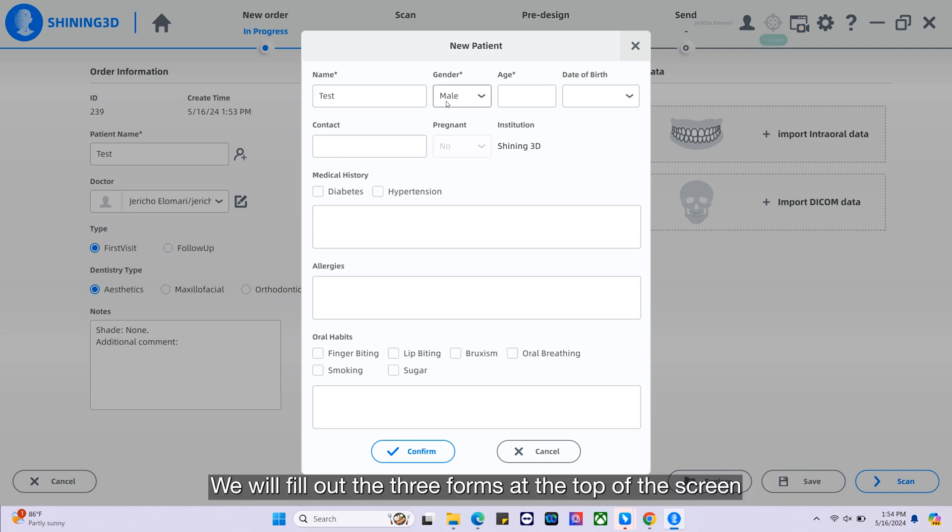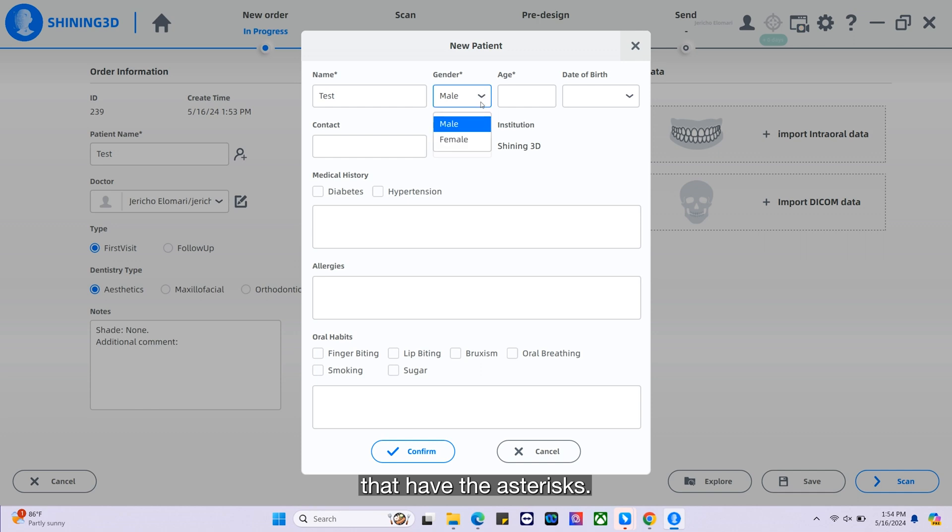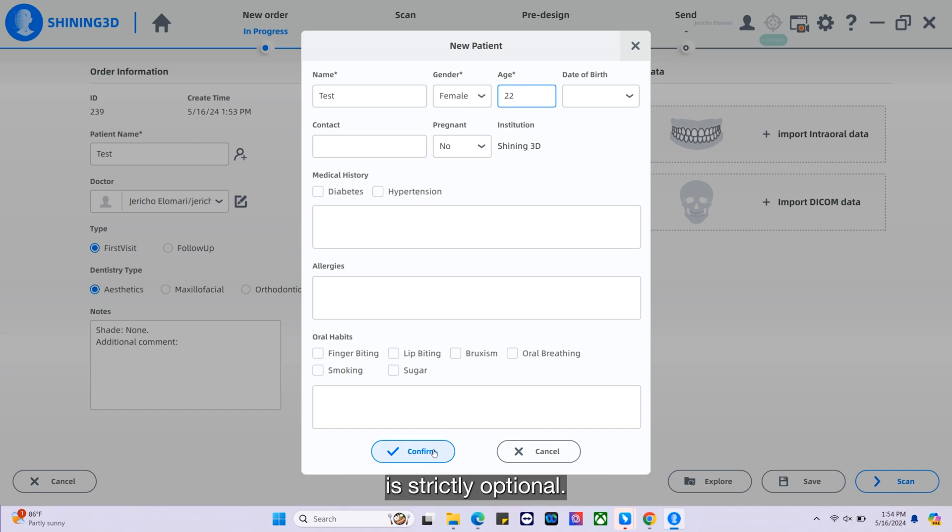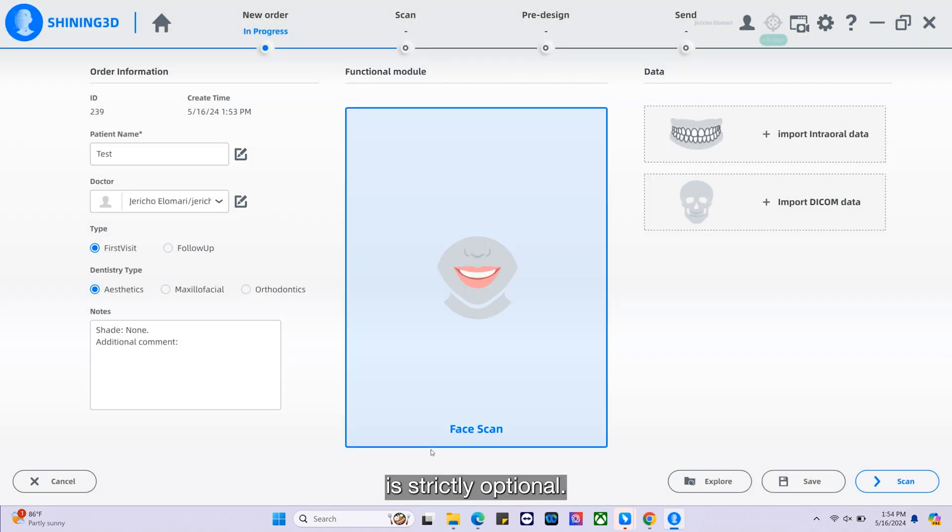We will fill out the three forms at the top of the screen that have the asterisks. The rest of the information is strictly optional.